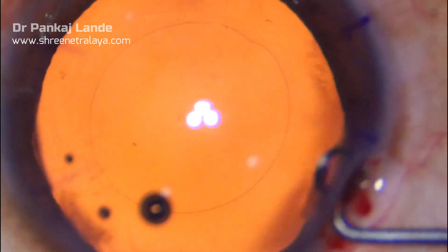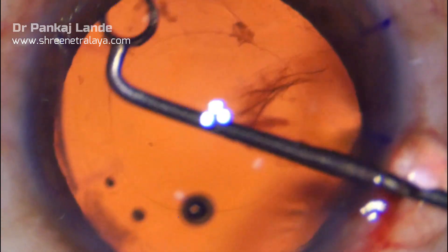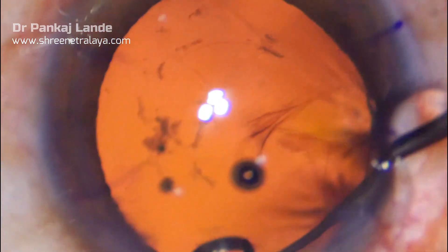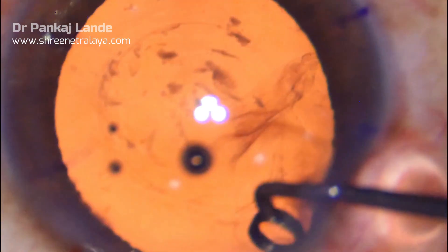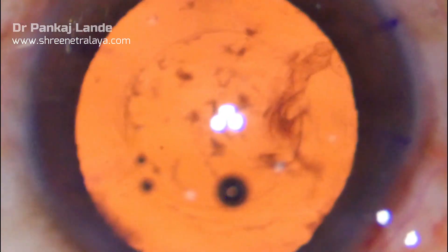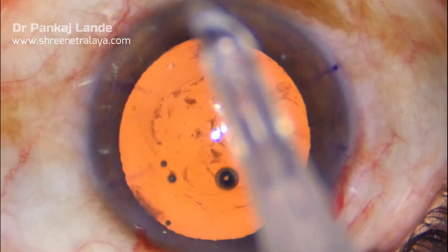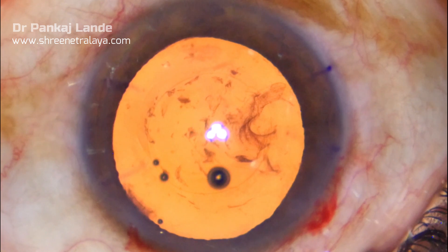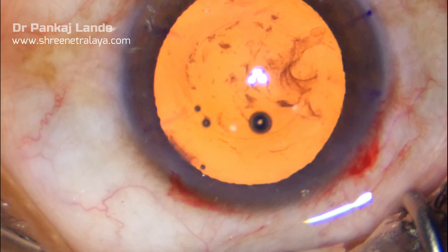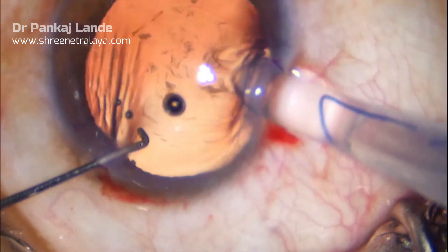Once the IA is complete, the anterior epithelial cells can be removed with a special instrument called a PC polisher. As this is a high myope patient, I am using a 3-piece foldable IOL, which in my opinion gives slightly more stability.